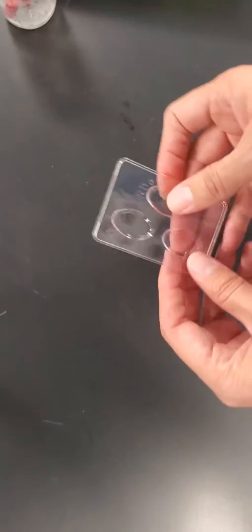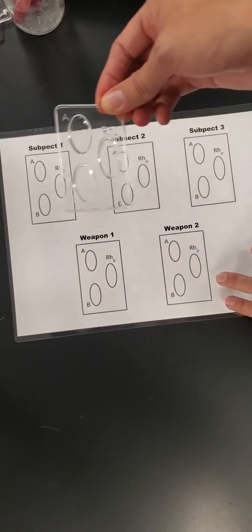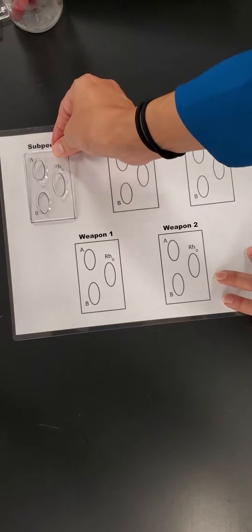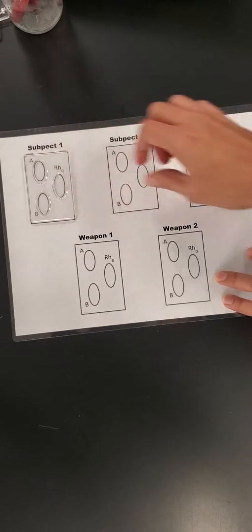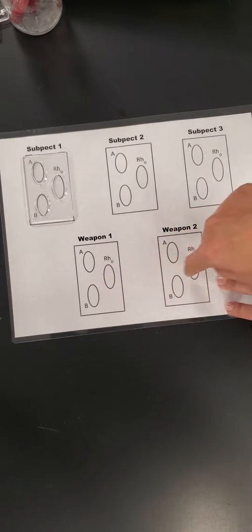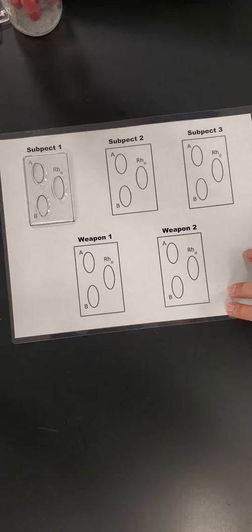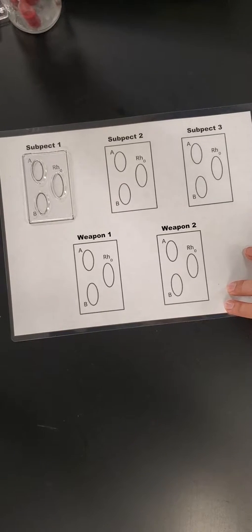In order to test the blood, I'm going to provide for you what we call a blood typing tray, and I'm also going to give a white background for you to test it. That way you can see the agglutination happen. And so you're going to be placing it like that. And again, if you notice, there's one for each suspect and then one for each weapon, and so you have a total of 5.